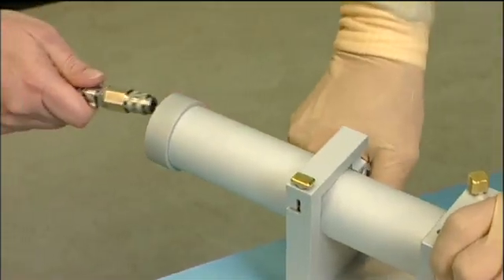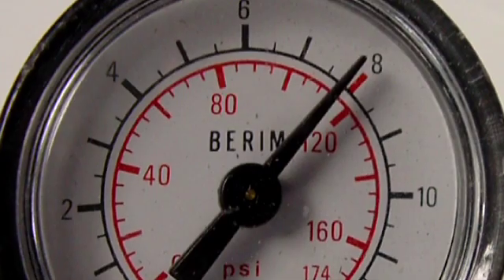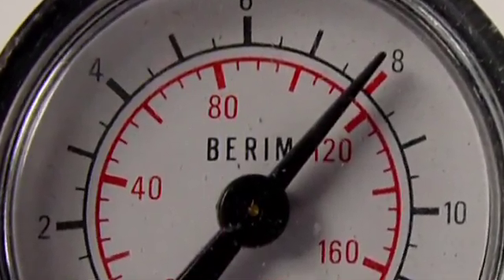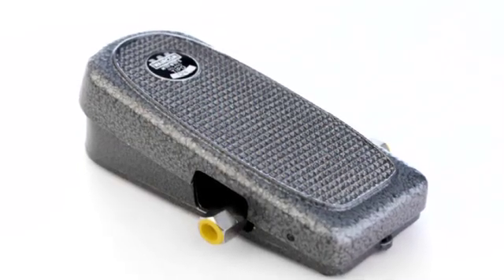The hose of the air supply is connected to the motor by means of a quick coupling. Required pressure is 5 to 8 bar or 70 to 120 psi. Air supply is controlled by means of a foot pedal.